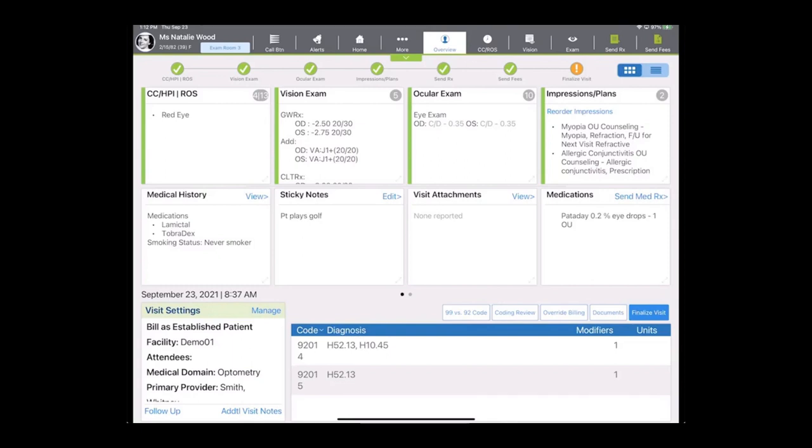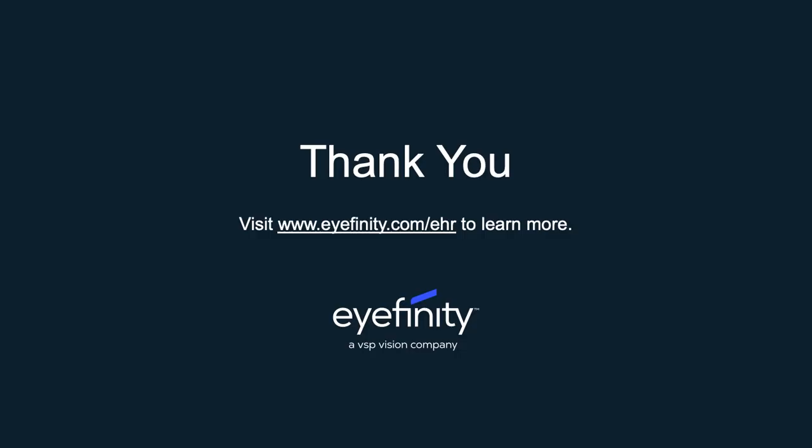Well, this concludes the quick overview of Eyefinity EHR. Thanks so much for tuning in. Have a great day.